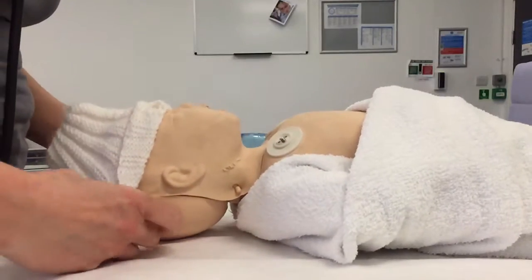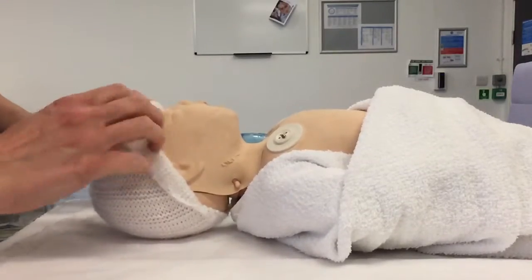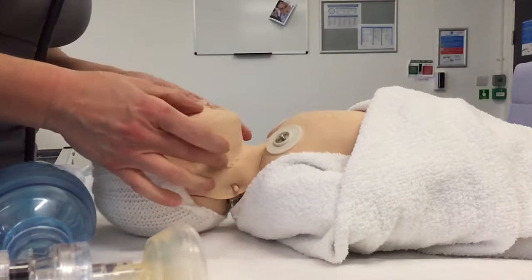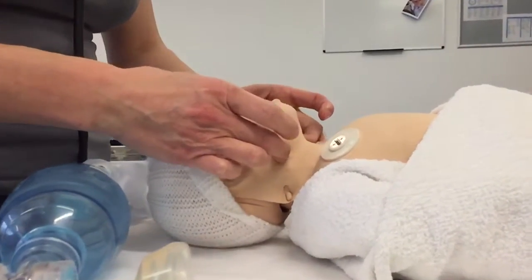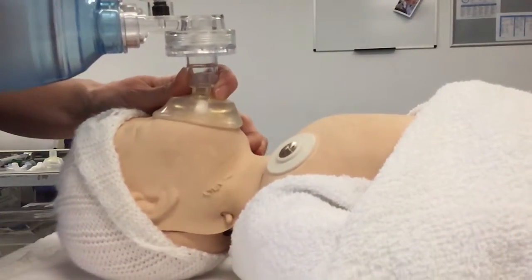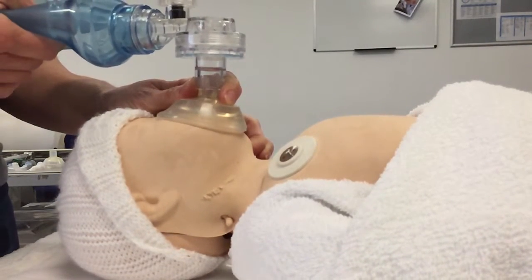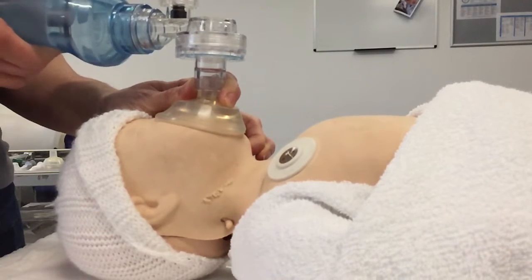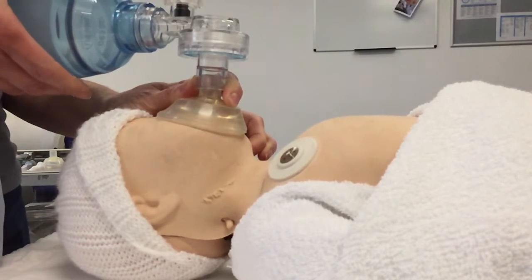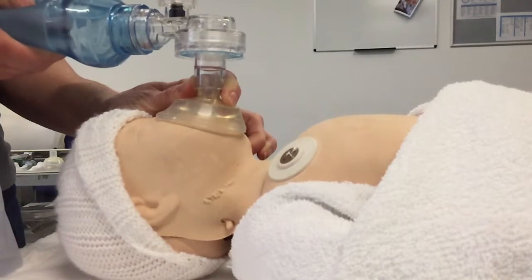I'm going to start with a single-person jaw thrust, as no help has arrived. To do that, I'm going to put my thumbs on the baby's cheekbones and use my fingers to bring the baby's jaw forward. Then I'm going to roll the mask up and over the top, holding the mask in place with that jaw thrust to try and bring the tongue forward and open the airway. I'll give five more long, slow, sustained inflation breaths.